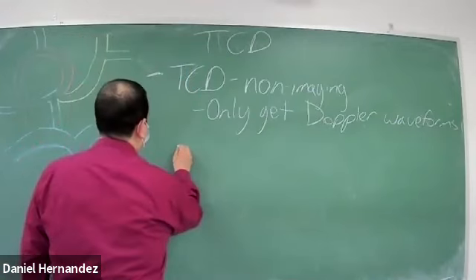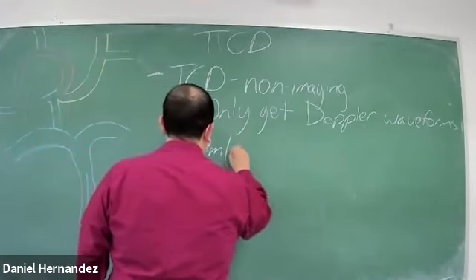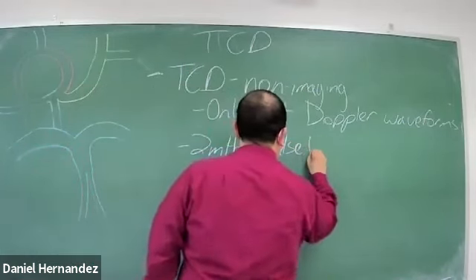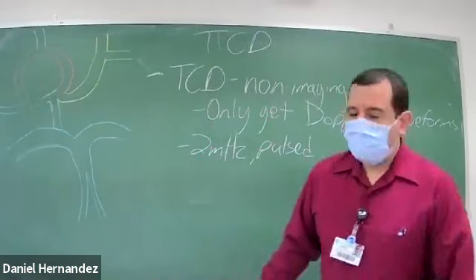With this one, we use a 2 megahertz pulse transducer.